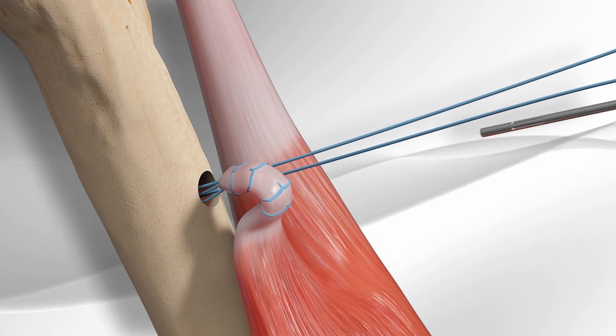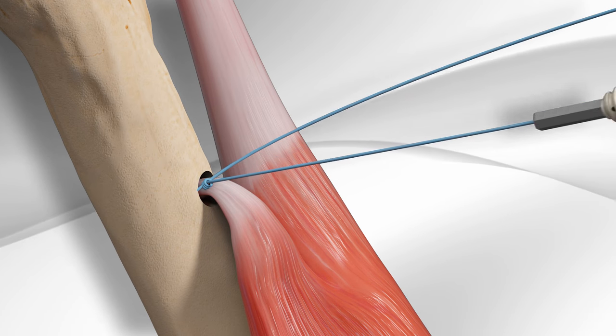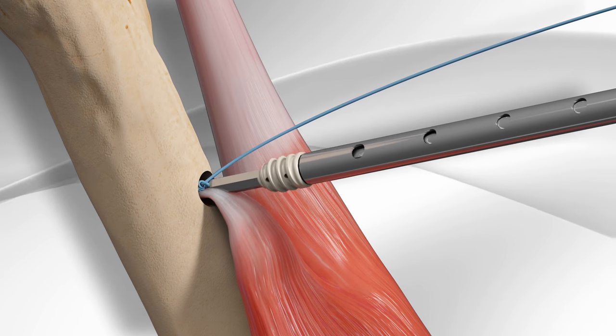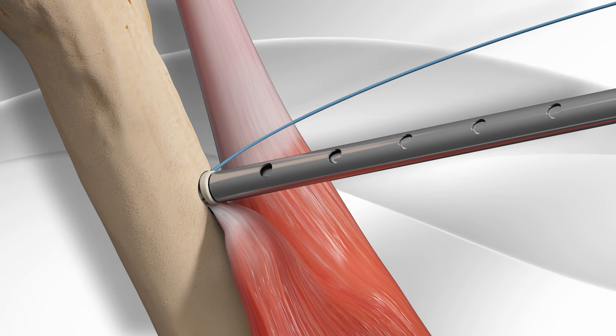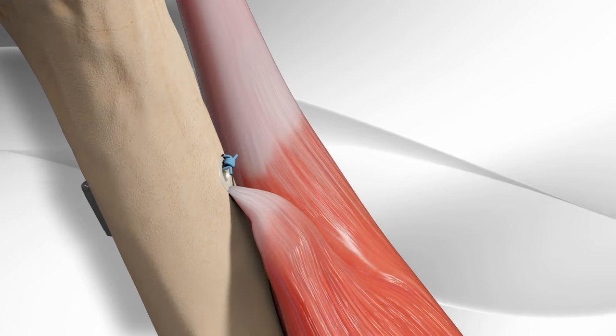The sutures are toggled, pulling the tendon tightly into the socket. A screw is inserted into the socket to permanently secure the tendon to the bone. This completes the repair.